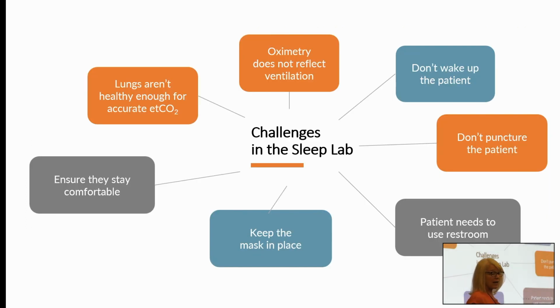Okay, so there's a lot of challenges that need to be addressed in the sleep lab in order to get a great overnight study. You don't want to wake up the patient, but you need to keep that mask in place. You know that pulse oximetry alone doesn't reflect your patient's ventilatory status, but you don't want to wake up that patient by sticking them for a blood gas.